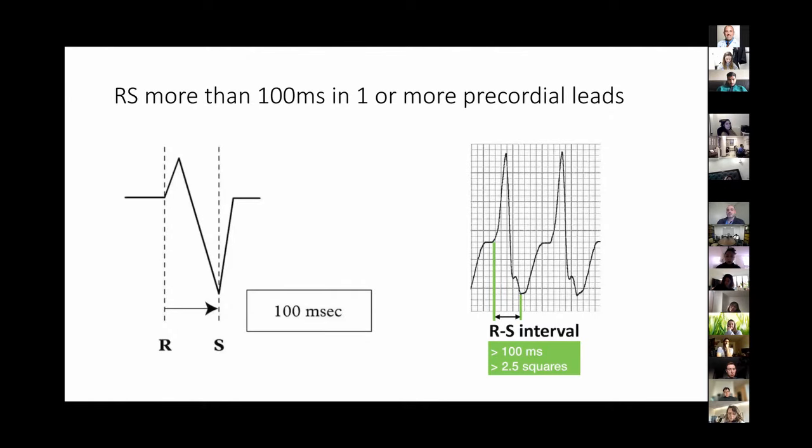Now, I have mentioned a bunch of these cutoffs, this milliseconds, that milliseconds, and all of those things are based on the following concept. If the myocardium in the ventricle has very abnormal depolarization that is ventricular in origin, the initial portion of that depolarization is going to be very slurred.